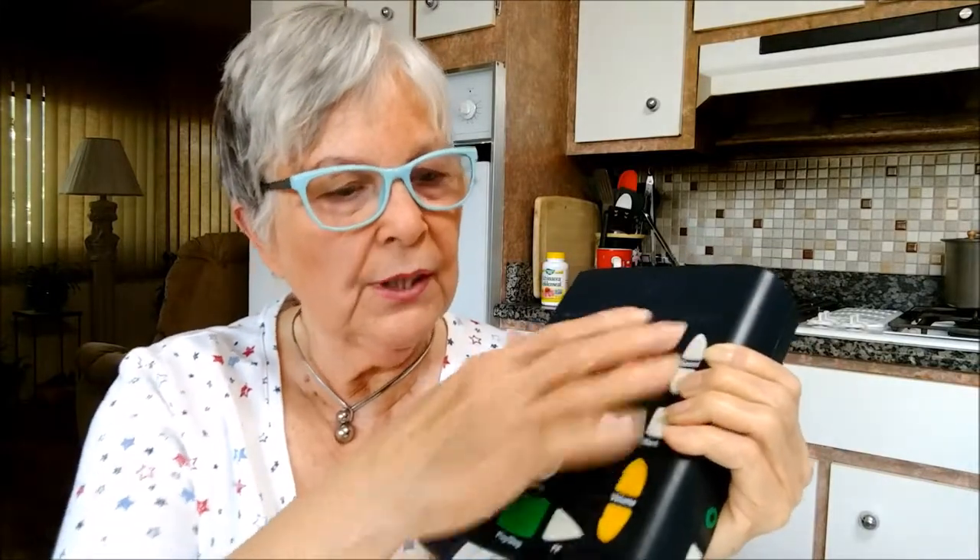When you take the book out, you can rotate through all of the button functions. When you put it back in, you can still utilize them.